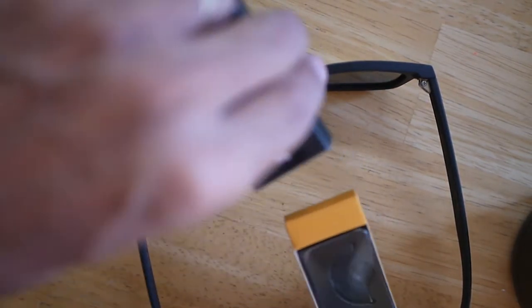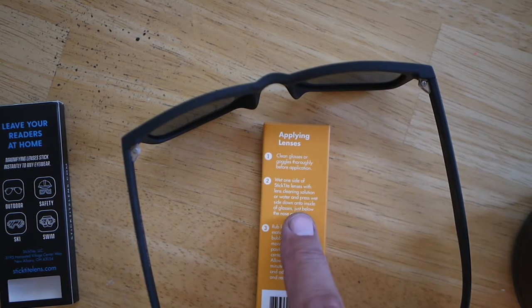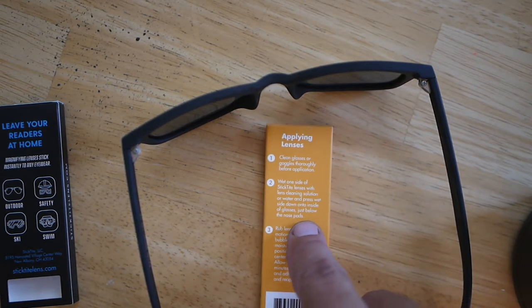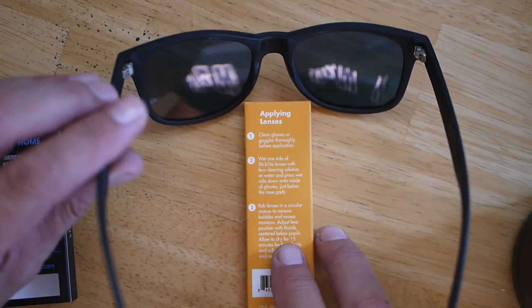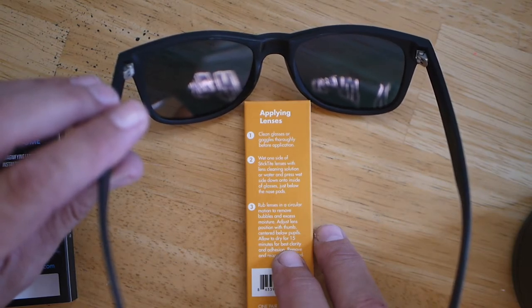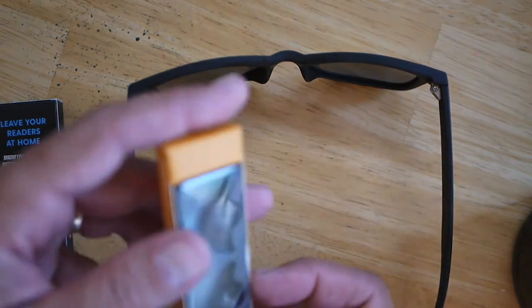So, what we're supposed to be able to do — we've got instructions. Let me read through them: clean your glasses thoroughly, wet one side of the stick-tight lenses with lens cleaning solution or water, and press wet side down inside of glasses just below the nose pad. Rub lenses in a circular motion, remove bubbles and excess moisture, adjust lens position with thumb centered below pupils. Allow to dry for 15 minutes for best clarity and adhesion. Remove and reapply as needed — so they are removable.